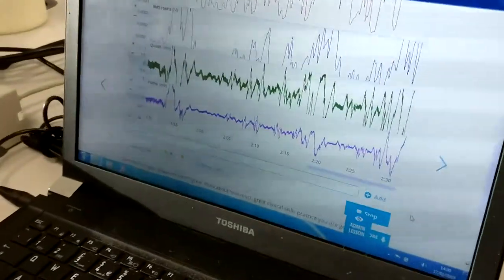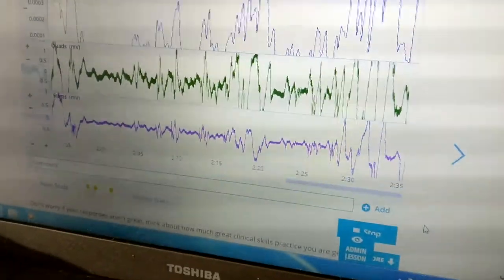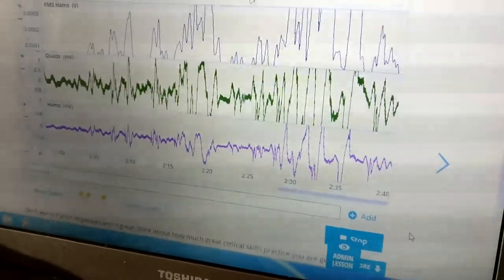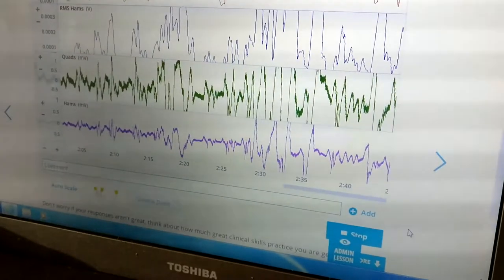If you just... Yeah. So here, that's the lowest. There we go. Yeah. That's it. Go down and up. So the little drop and then the skip there, that's a reflex. There we go.